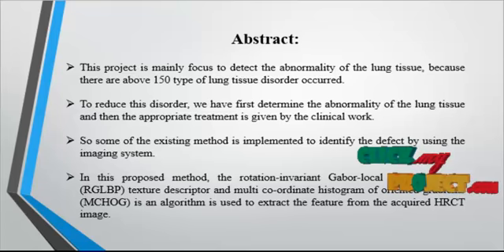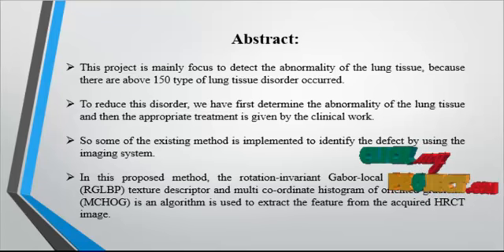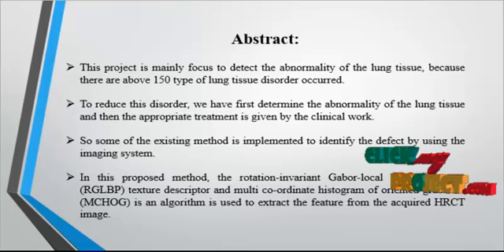Now we discuss the project feature-based image patch approximation for lung tissue classification. In this paper, we propose a new classification method for classifying 5 categories of lung tissues in high-resolution computed tomography images with feature-based image patch approximation.